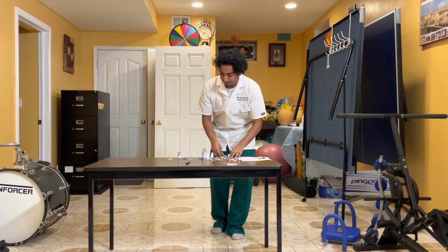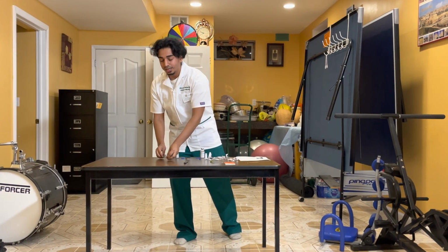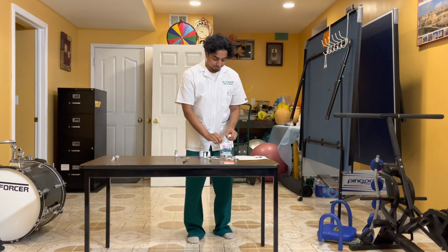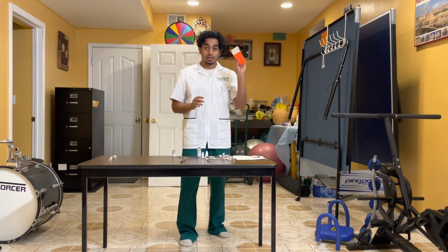Perfect. Now that it's in, I cap it up and I put this needle into the hazard bin, the sharp object hazard. Now once I have that, I'm going to be taking my medication label.